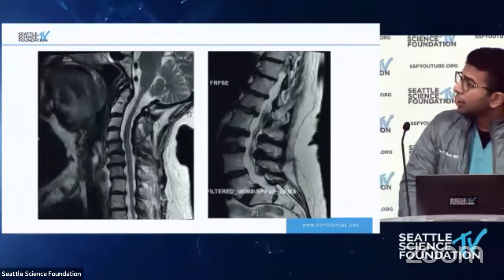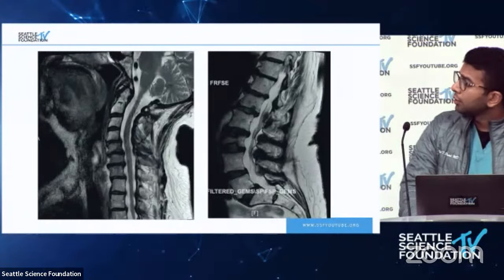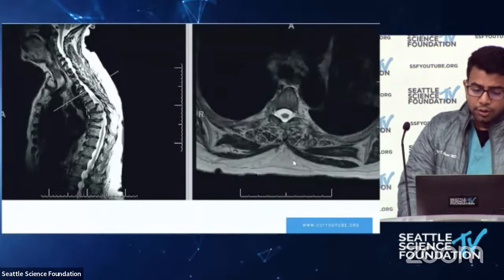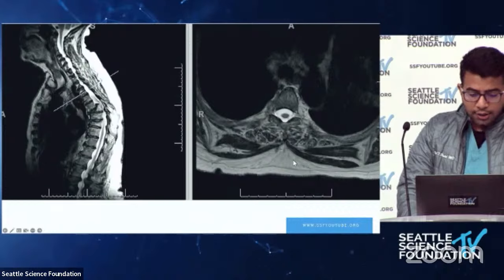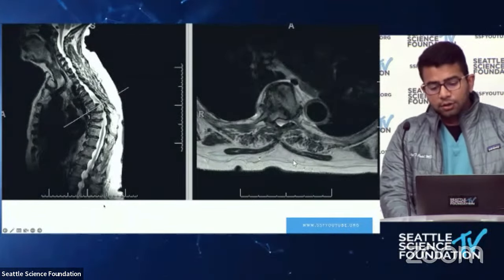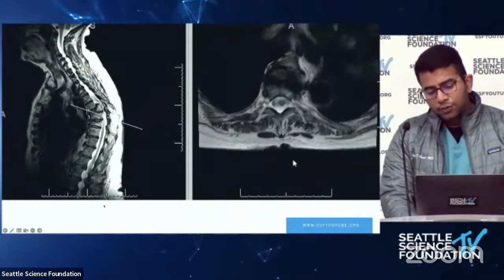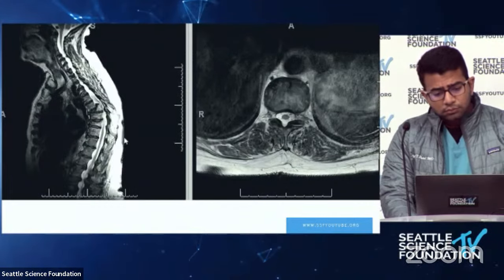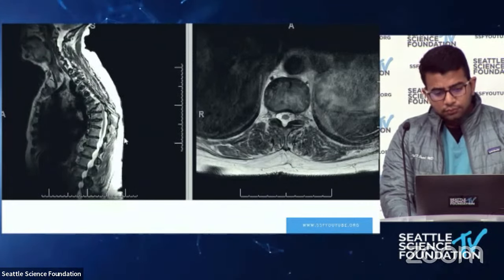So we ended up doing cervical and lumbar MRIs as well because of significant myelopathy, with clearly no significant discs there. And we did do a thoracic MRI. You could see, again, significant kyphotic deformity and severe stenosis of the central canal. Dr. Chang, what's going on there? Why does a patient's spine dislocate like this? If it's just osteoporosis, wouldn't it just kyphose? What's this pathomechanism that we see going on here?